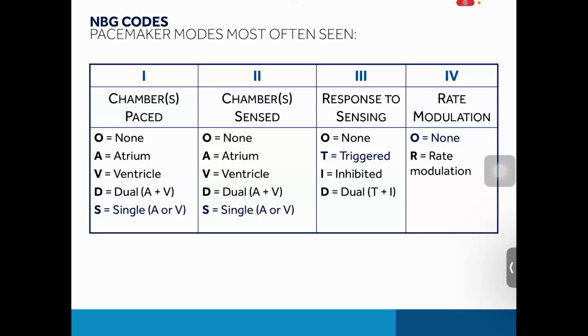There is a big confusion that sometimes we tell a doctor, we have a DDD pacemaker. DDD means the mode, but you should call the device by its type. We have an implantation of a single chamber pacemaker or dual chamber pacemaker, single chamber ICD, dual chamber ICD, or CRT that has a third lead in the CS.